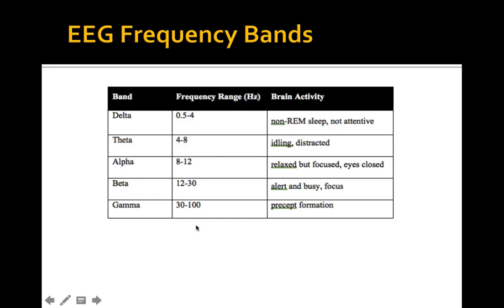So in order to talk about parameters, it is important to talk about frequency bands. Most EEG parameters are determined from the frequency domain, but not all. Usually clinicians will look at a signal in the time domain and issue reports based on that. But researchers tend to look more in the frequency domain, especially when looking at data from a single channel.